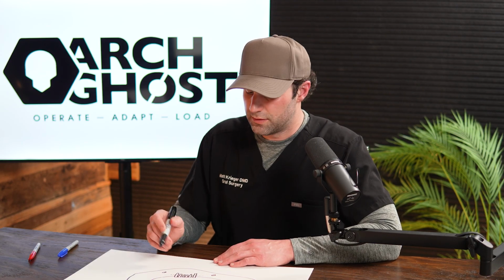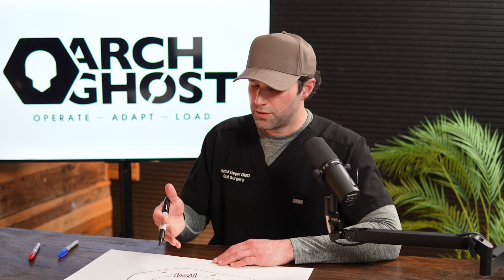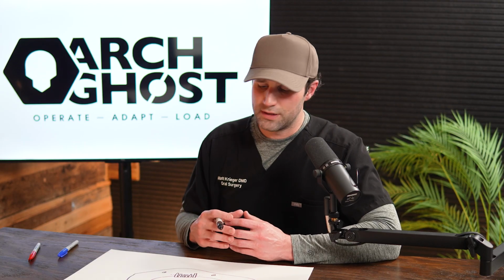So now, again, there are going to be cases that are either maybe some of it's still there or you need significantly more depending on the reduction requirements. But the vast majority of cases, you'll reduce down to the point where you just eliminate those central incisor sockets. So the key to this landmark is just that shouldn't be your only measurement.